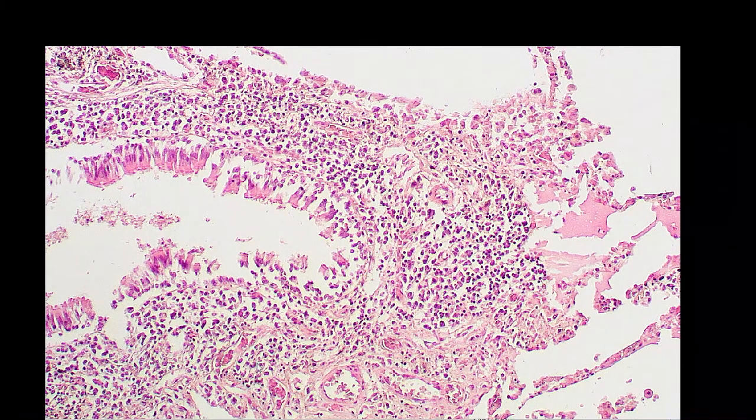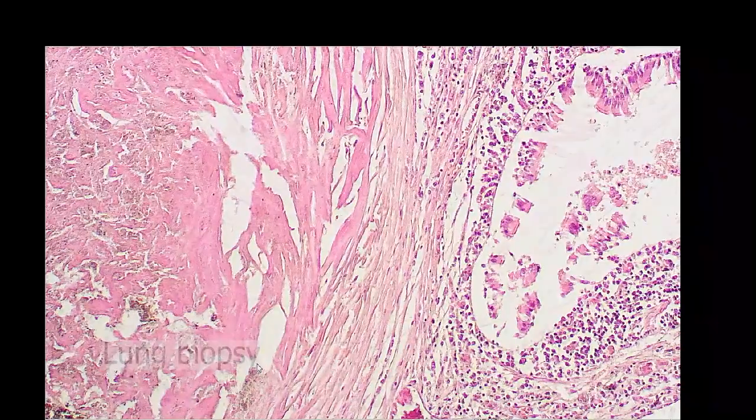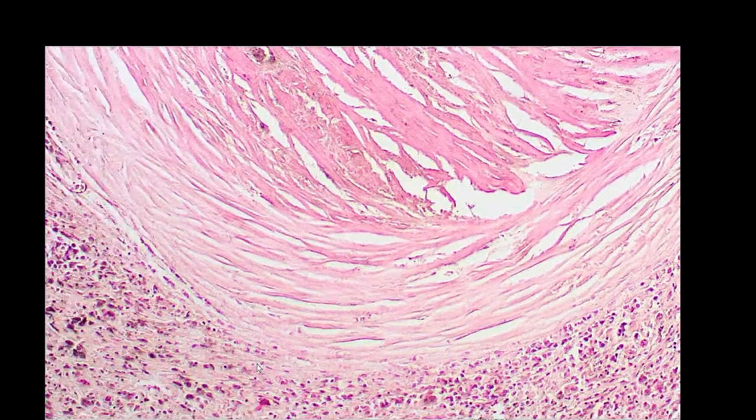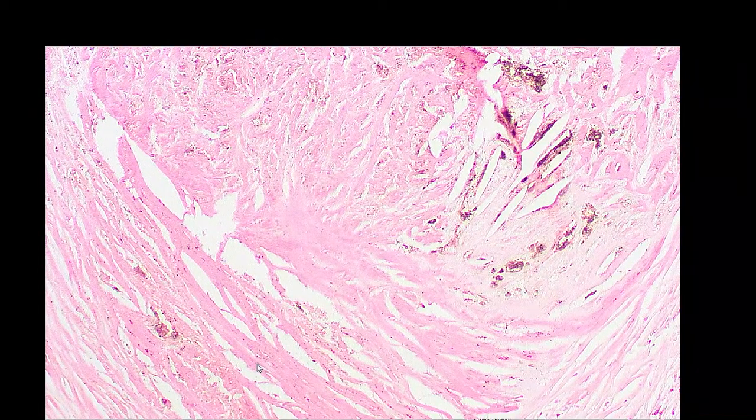This is just showing an example of what happens when that is complete. This is a lung biopsy in a patient who's exposed to a lot of silica, and this is a big scar that's been left. So this is the end product of that process of granulation tissue, and you can see it's really just pink, wavy, hyaline tissue.